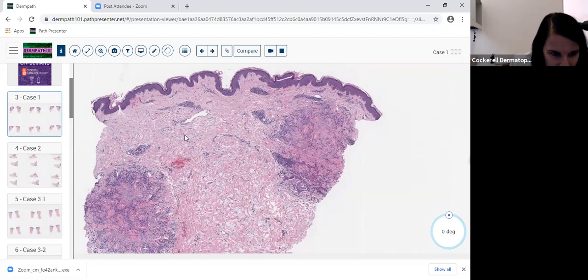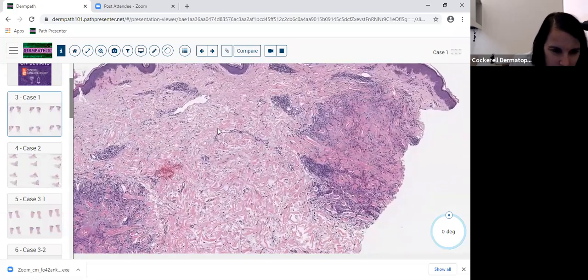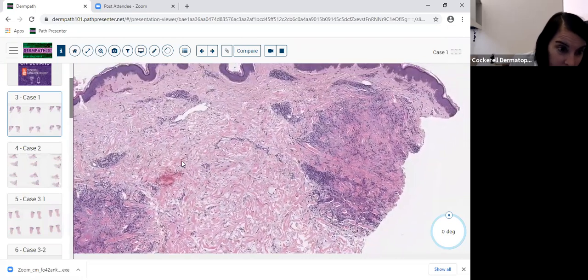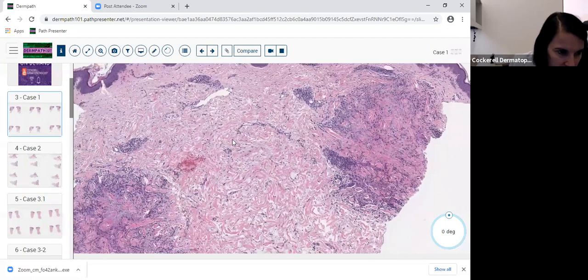Again, you might need a clinical path correlation on that, but typically you'll see the histiocytes percolating in the dermis without the palisade, and a little bit of mucin. You'll see little wisps of mucin every now and then. You can see it, or sometimes no mucin at all, and you have to say, hey, this is interstitial GA. There's a lot of histiocytes, and they're percolating in the dermis.